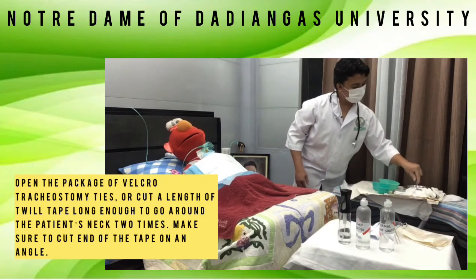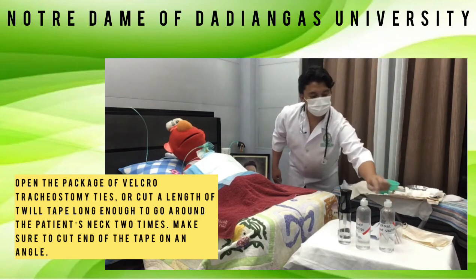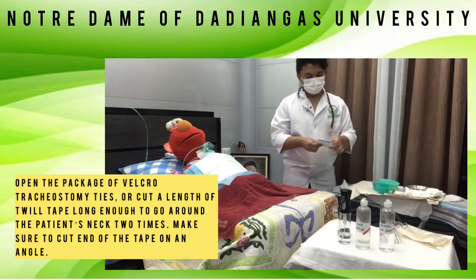Open the package of Velcro tracheostomy ties or cut a length of twill tape long enough to go around the patient's neck 2 times. Make sure to cut the end of the tape at an angle.